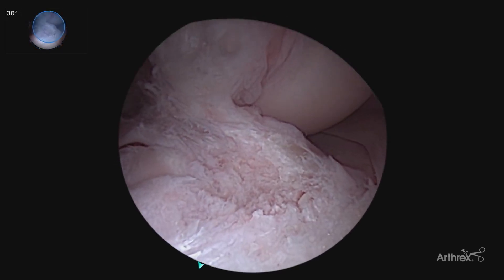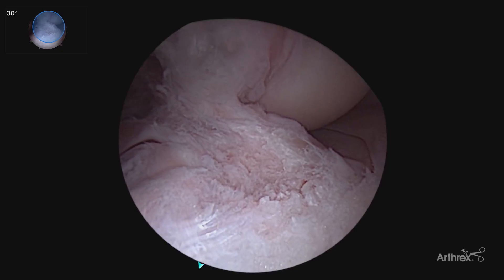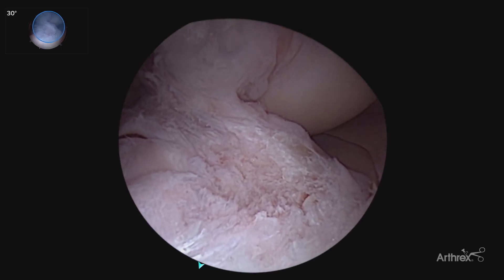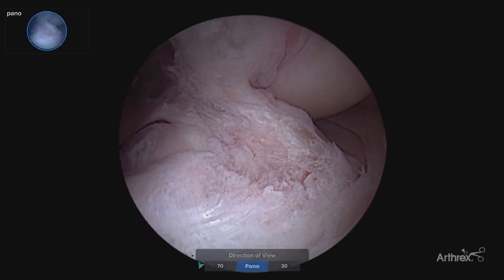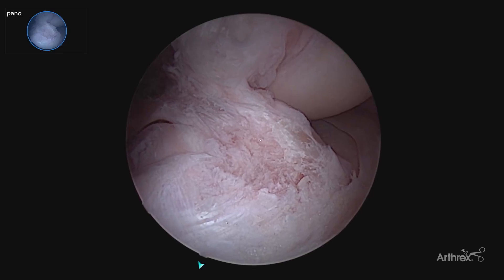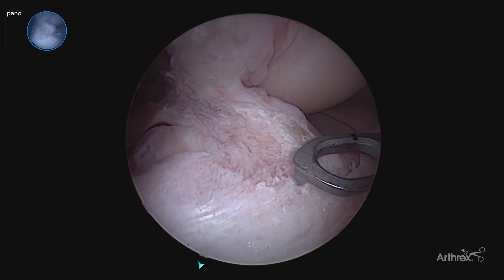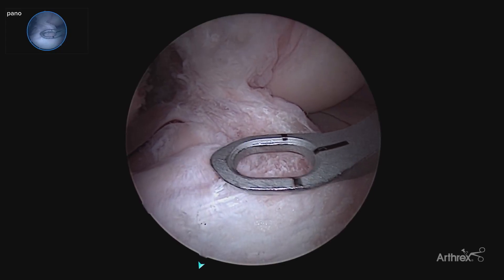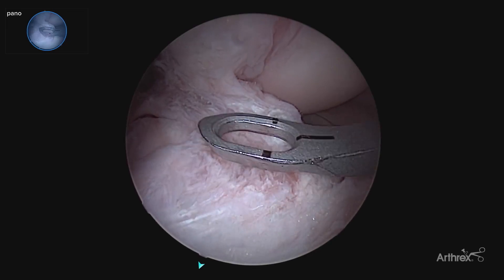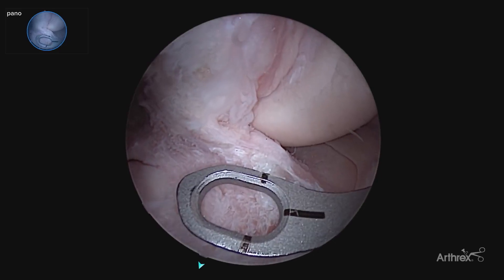Here we are preparing our tibial tunnel guide pin placement. We've cleaned off the ACL footprint with our typical 30 degree arthroscope view, utilizing our references of the tibial spines, the anterior horn of the lateral meniscus, and the intermeniscal ligament. Our typical 30 degree view gives us that slightly oblique view. By switching to our panoscope, we get a much broader view, allowing us to more easily visualize all of those frames of reference, also allowing for better depth perception and placement of our guide — seeing in one view our intermeniscal ligament, our anterior horn of our lateral meniscus, and our tibial spines, allowing us to triangulate for very accurate guide pin placement. It also allows us to look directly at the pin coming in with a bird's eye view versus a more oblique shot, confirming our more accurate pin placement.